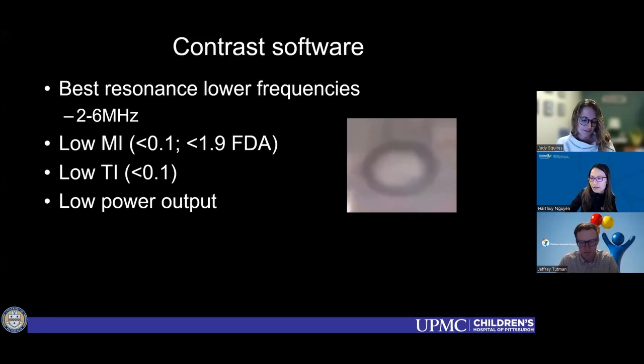Yes, that's interesting that you mentioned that. I didn't really realize the physics behind it, because I usually do use the linear probe when I image bowel, just because the bowel walls and everything look so much better. But I haven't found the enhancement, I guess the only ones I refer to are really sick or abnormal bowel. A lot of times it doesn't enhance as much, but I do compare it to other things just to make sure that it's not just related to technique, because we do look at vessels nearby too for comparison purposes. And then those are resected or not.